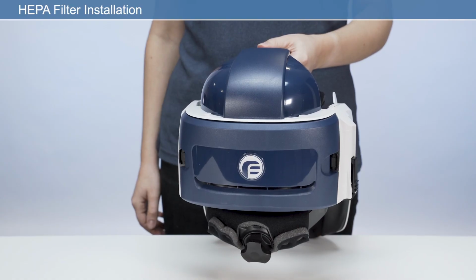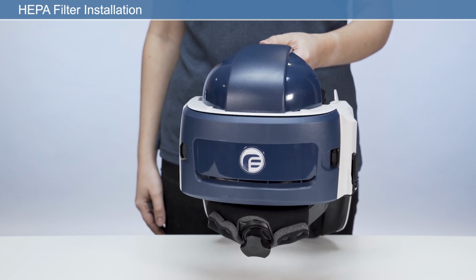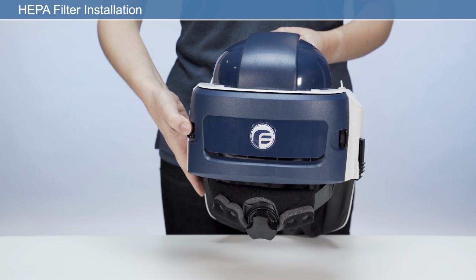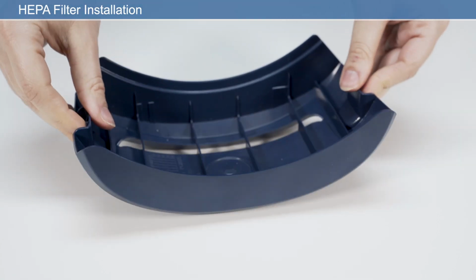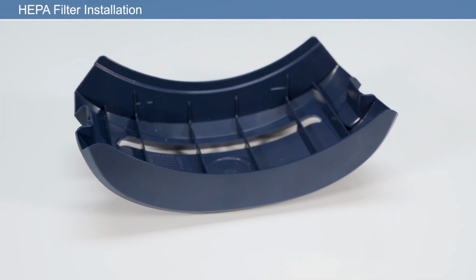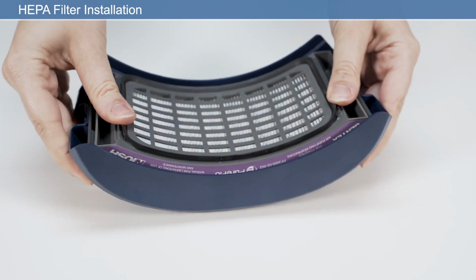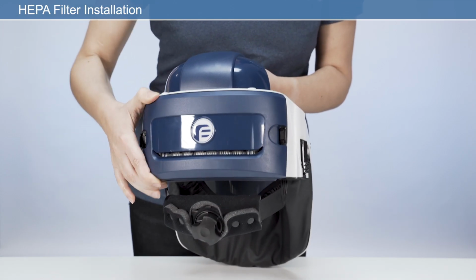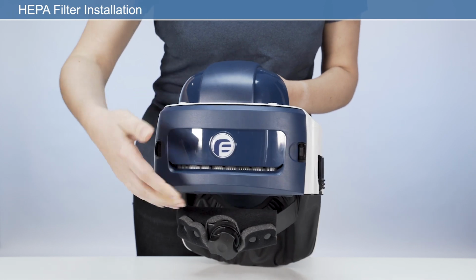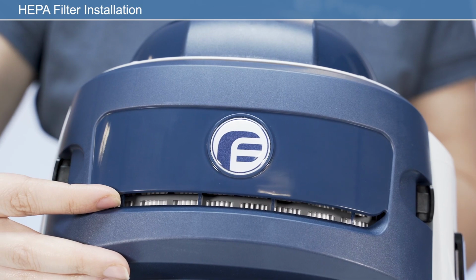To install a new HEPA filter, remove the filter housing by pressing either the left or right latch on the back of the unit. Place the HEPA filter into the rear of the filter housing, ensuring the filter label faces upwards as worn. Then, applying firm pressure, click to engage the filter housing with the 2 filter latches as shown. After fitting the filter, check that the air inlet is clean and free from any obstructions.